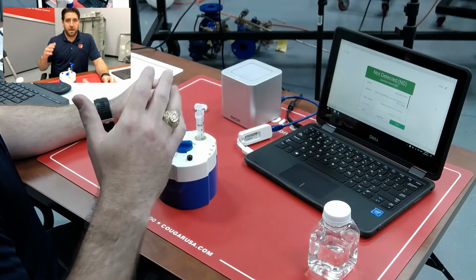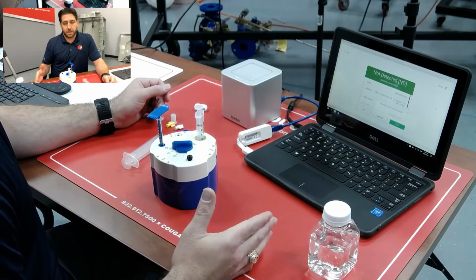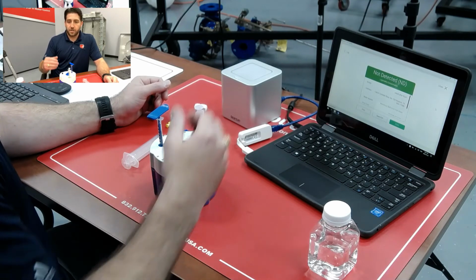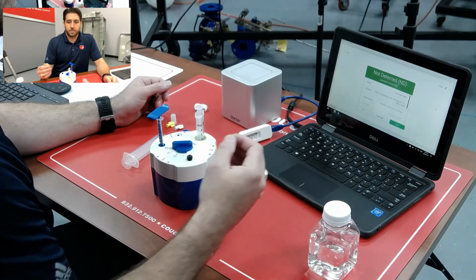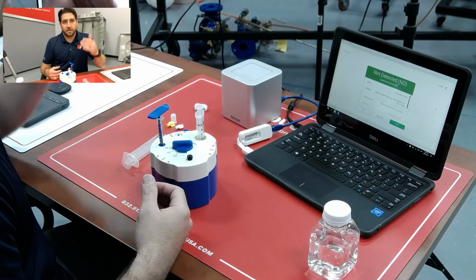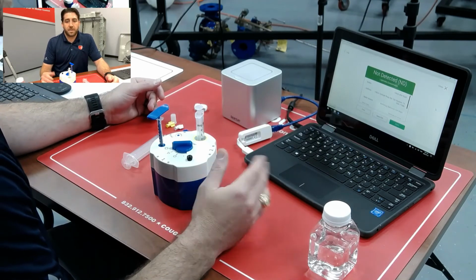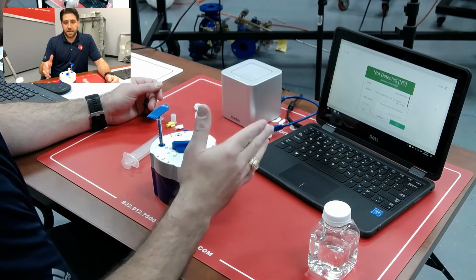The levels for the non-potable water side are going to be 10 times that. So anything over 100 starts to get more of a concern, and then anything over 1,000 would be that immediate action to take for remediation. So when we got our test of that 3.5 genetic units per milliliter, we flushed the hot water system, opened up the sink, let the hot water run for about 10-15 minutes, and then we took an additional sample, and that's what you're seeing the results here of not detected. So this is where we want to be on the potable water systems, is not detected.